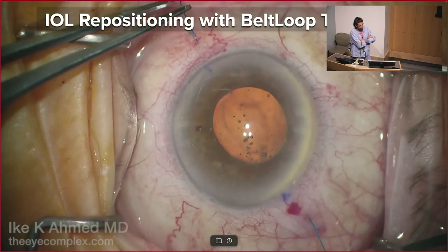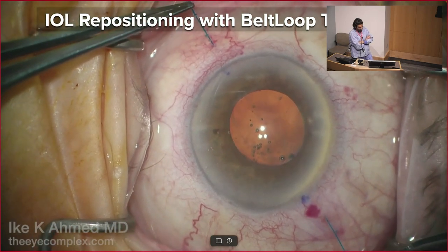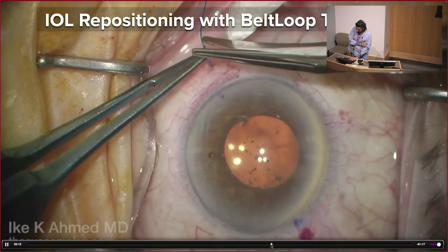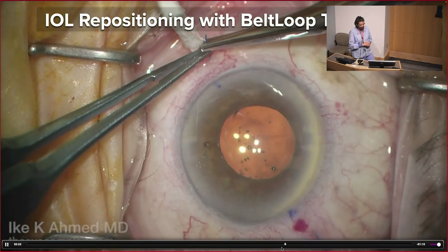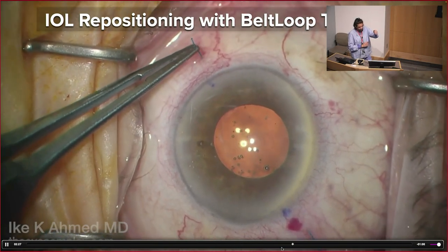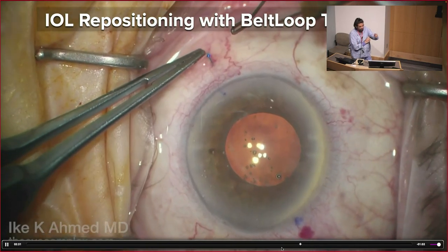So here's a bit of pulling on either side to get that lens well centered. Again, take the time to do this really well, and then we'll deal with the nasal side first. You can see we actually edited this. We continue to trim it down to what we're happy with. It helps to pull the lens to ensure we have tension, so we know we have no laxity on that suture, and pull it almost over.